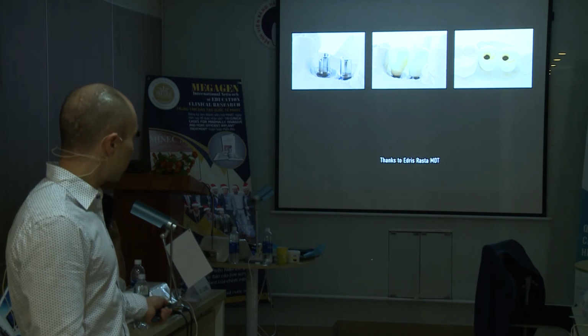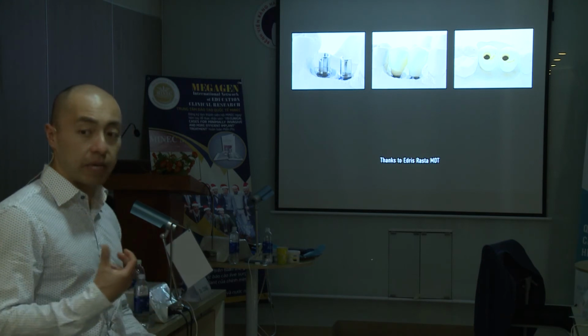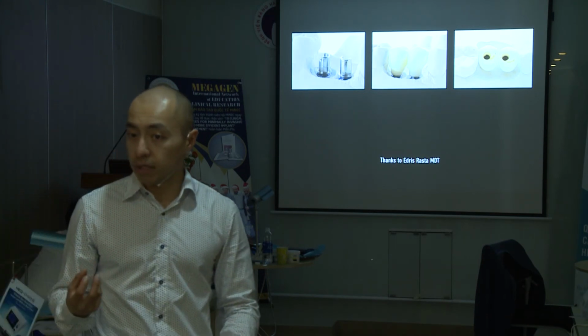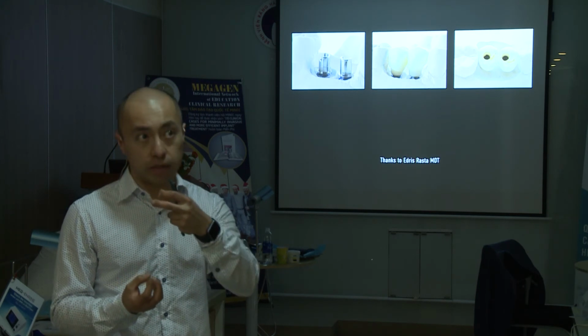Titanium base for the zirconia button. So the inside part for the implant is never fully zirconia. It's titanium. On top we make zirconia.